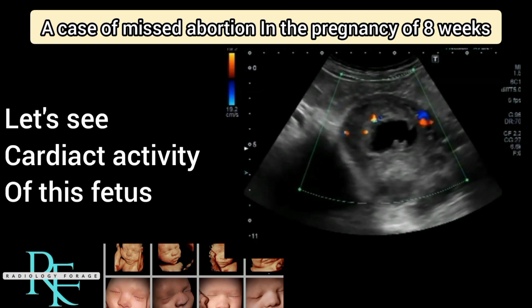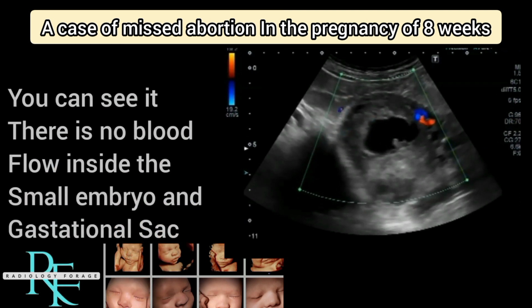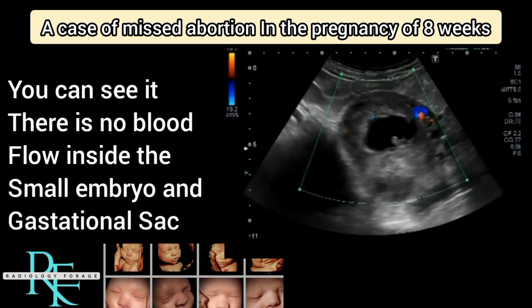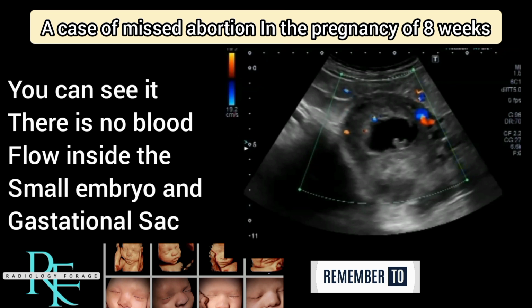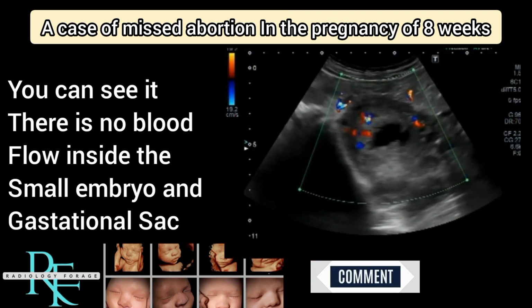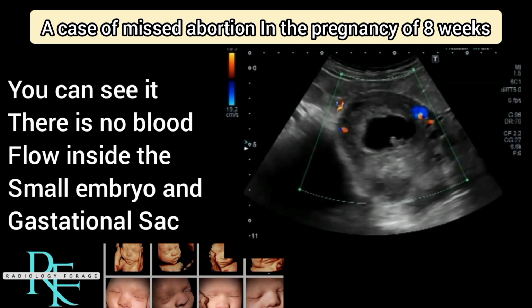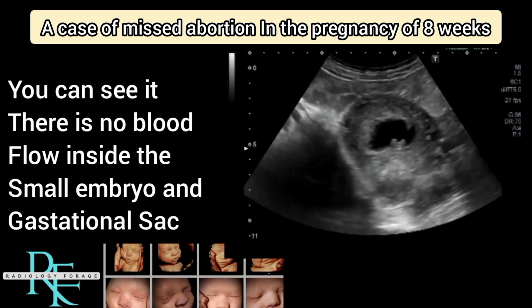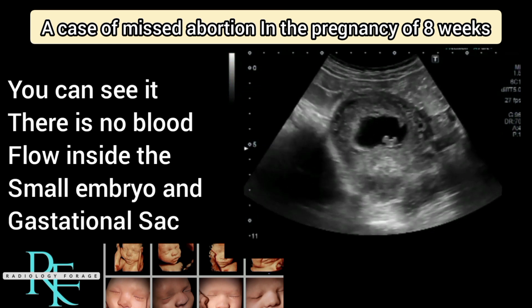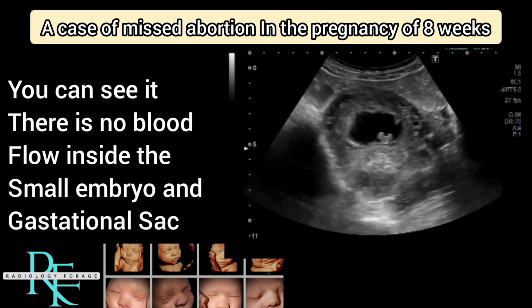Oh no, there is no cardiac activity in this fetus and gestational sac. There is no blood flow in this fetus and small embryo and gestational sac. I will try to zoom this image of this fetus. This is a dead embryo. There is no blood flow inside the small embryo and gestational sac.